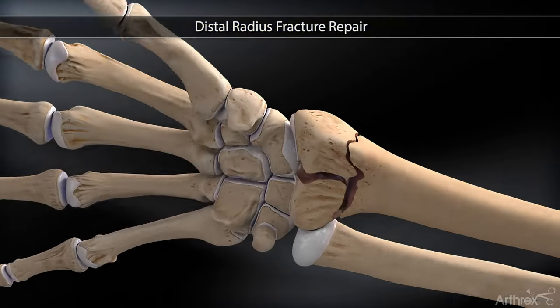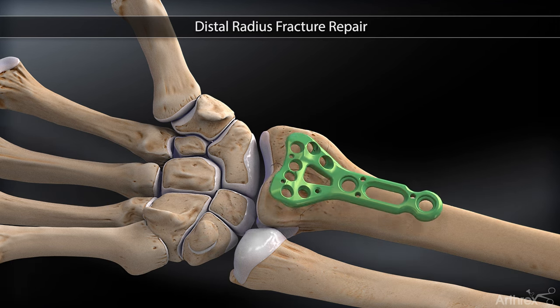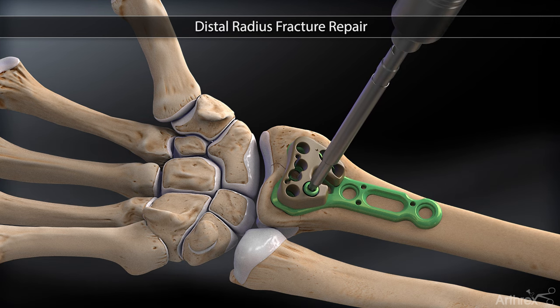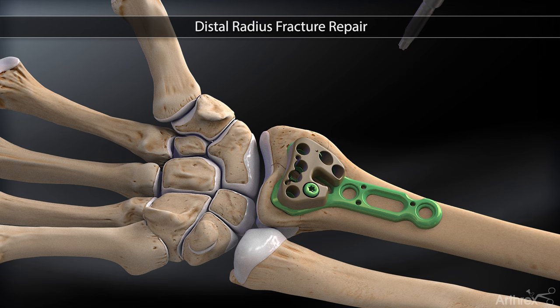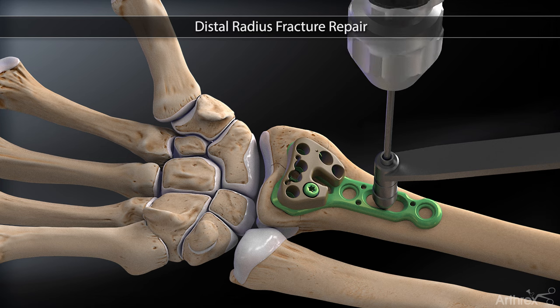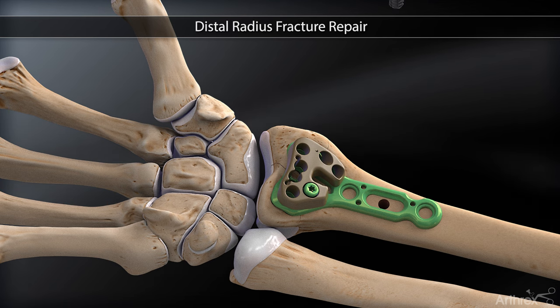The fracture fragments of the distal radius are reduced and the volar distal radius plate is applied to the bone over the fracture site. The peak aiming guide is secured to the plate with the set screw. Next, the 3.5 millimeter non-locking screw is placed into the slotted hole of the shaft for temporary fixation.